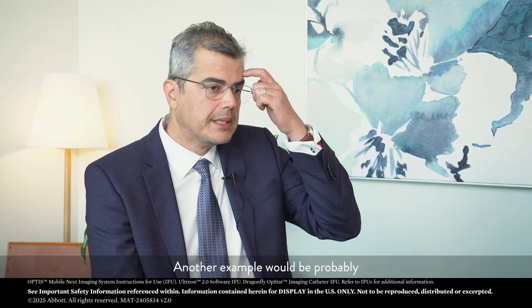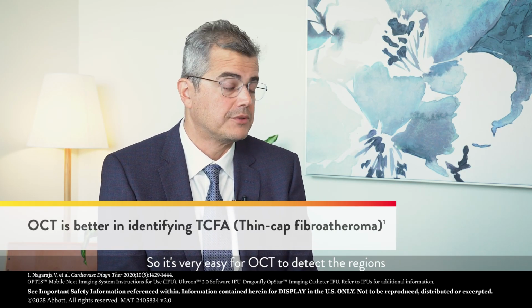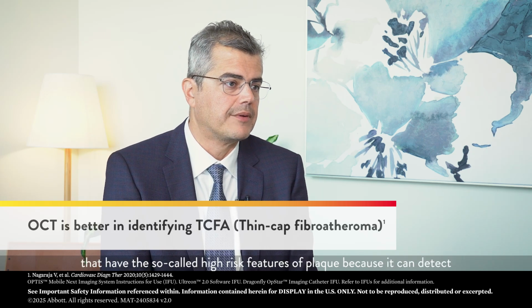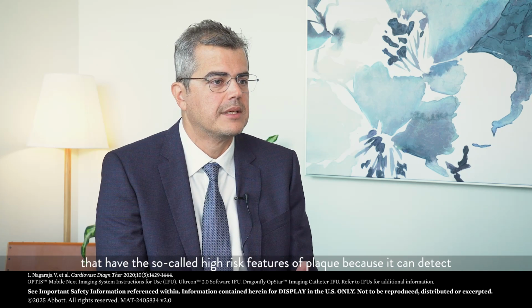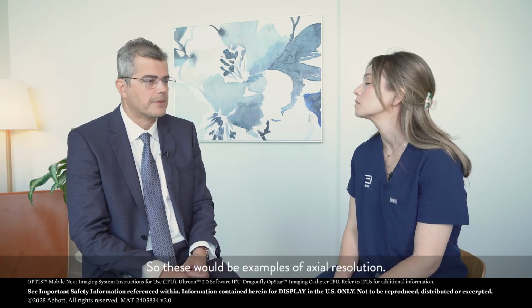Another example, probably even more relevant from a clinical standpoint, is the situation of a thin fibrous cap covering a lipid-rich plaque. It's very easy for OCT to detect the regions that have so-called high-risk features of plaque, because it can detect thin-cap fibroatheroma, or TCFA, which IVUS resolution is unable to. So these would be examples of axial resolution.